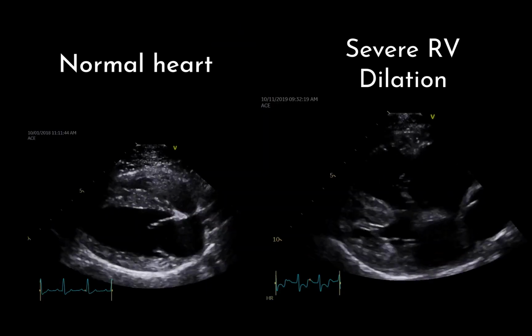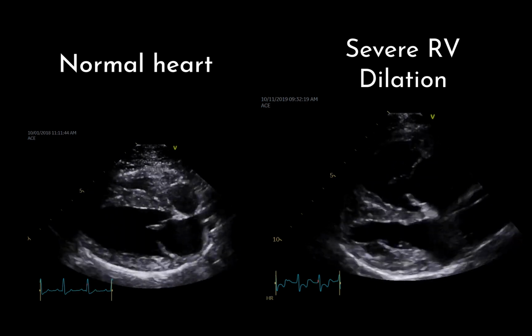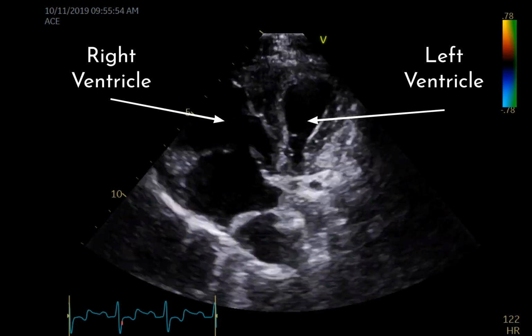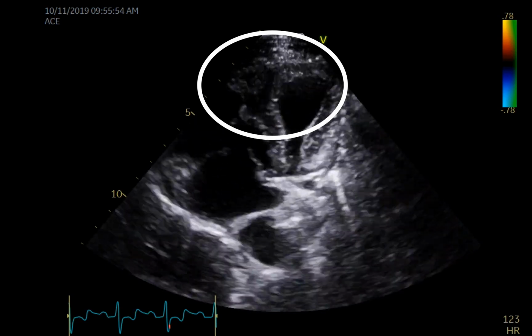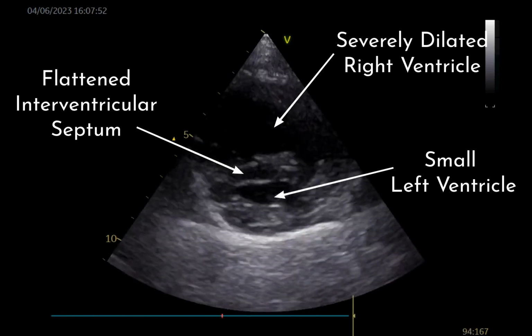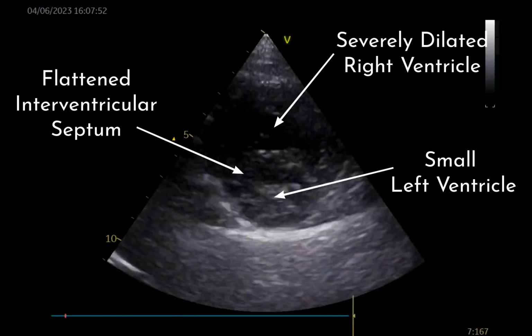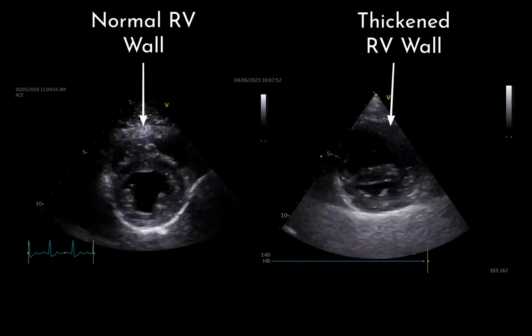By knowing normal anatomy and function of the RV, one can detect signs of RV dilation and strain on bedside echo. These signs include the following. First, increased RV to LV ratio. Second, RV may become an apex-forming ventricle on the four-chamber left apical view, which is not normal. Third, due to the RV dilation and strain, it may deflect the interventricular septum towards the LV lumen, causing a D-shaped LV. Finally, RV wall may get thickened due to high strain and increased work.